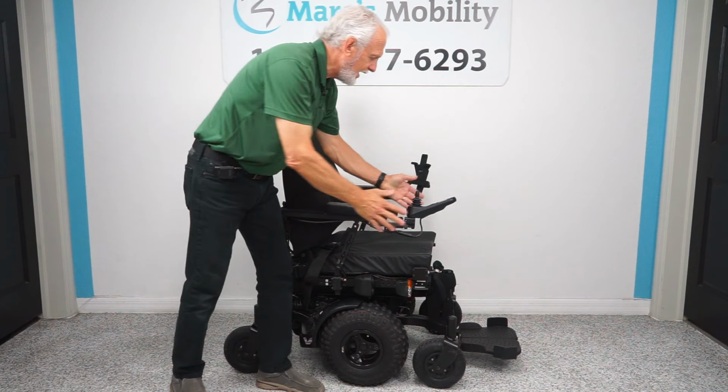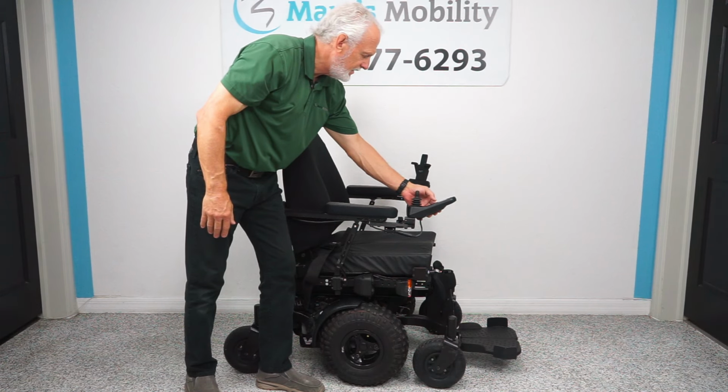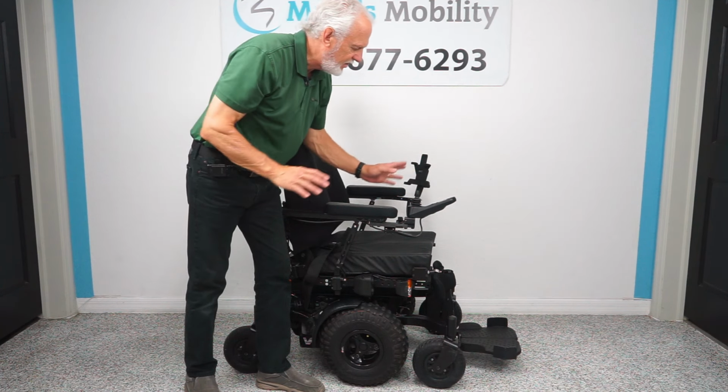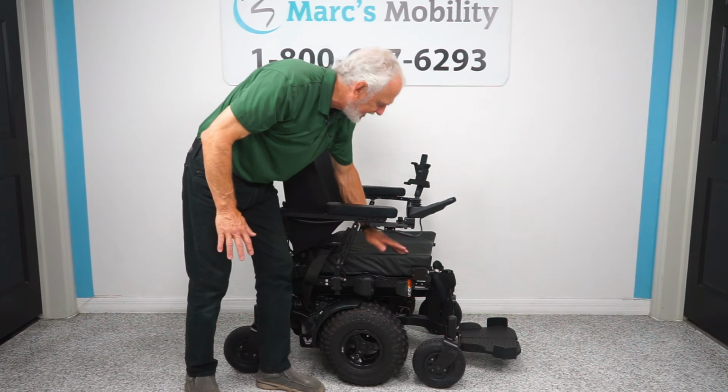The seat lift, you would have to go here and go to your mode and hit the mode button until you see a picture of your whole seat in the screen. Whatever portion is black on the screen is the function it's going to work. So right now I want the seat lift. I just want the cushion to be black in the screen.